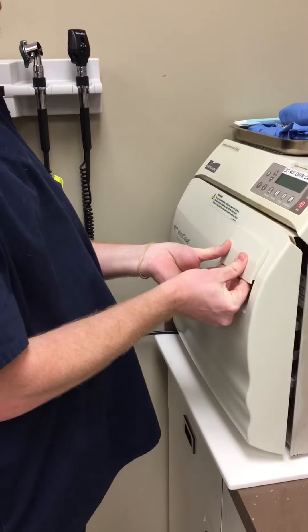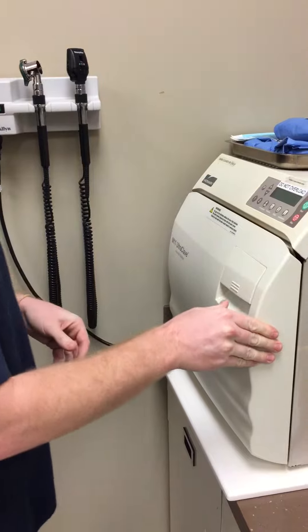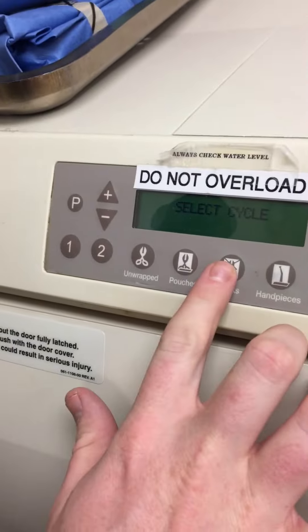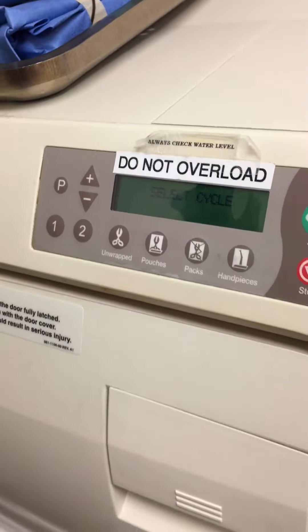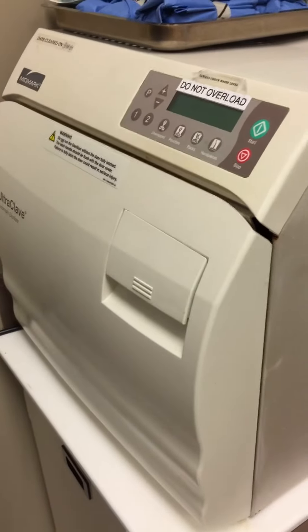Then we're going to choose the appropriate time. Ours has been already set up so we can just press 'packs,' which I would press. Our machine is actually one that automatically reduces the pressure.